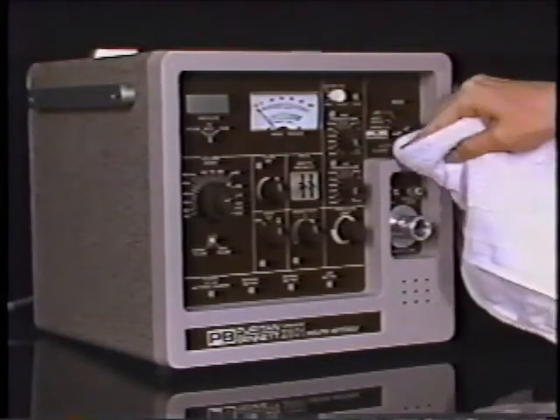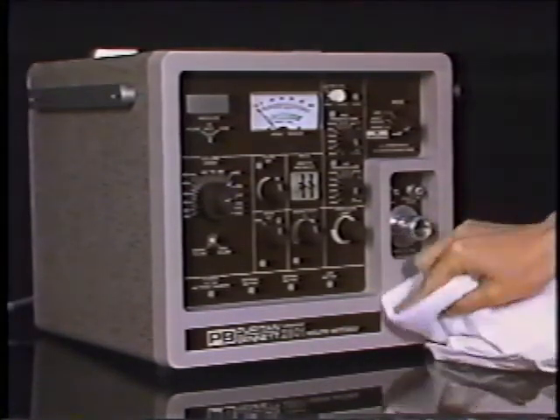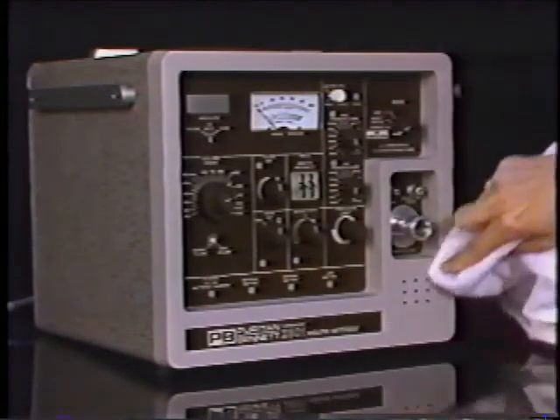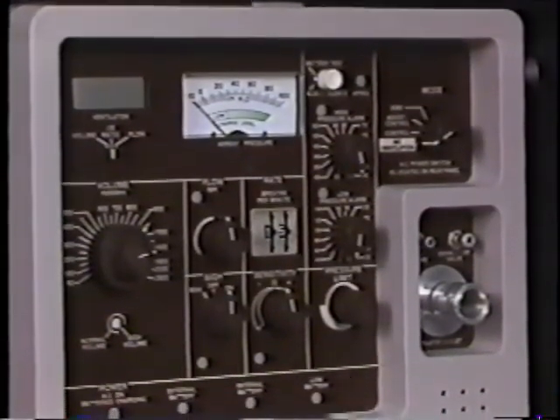Finally, it is important that the ventilator and accessories be cleaned and maintained. For more details, reference should be made to the operating instruction manual. This completes the review of the Companion 2801.